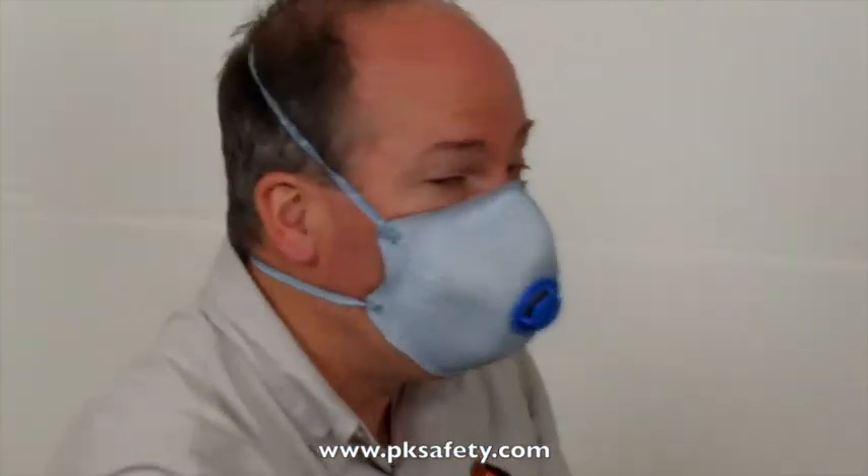You'll see the straps on here. Very popular mask, and I hope it works for you. Thank you.